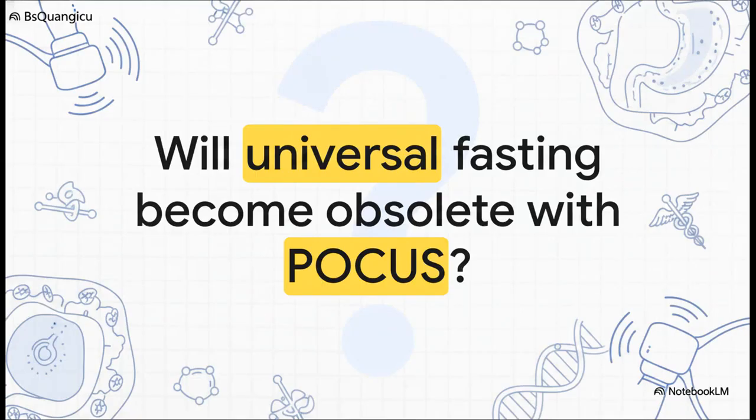Which really brings us to a fascinating question to leave you with. As pharmacology keeps evolving and delayed gastric emptying becomes more of the norm rather than the exception, are the days of the universal nothing by mouth after midnight rule numbered? With Point of Care Gastric Ultrasound, we finally have the tool to stop blindly watching the clock and start making precise, individualized assessments of the actual human being in front of us.